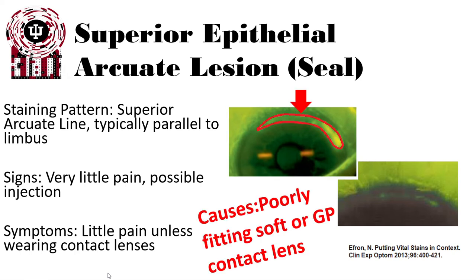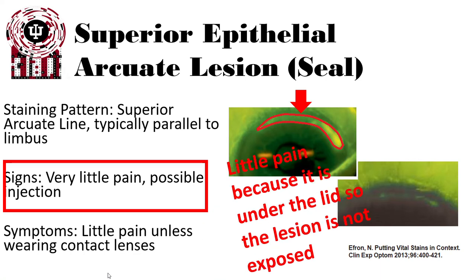I've outlined here so you can see the SEAL lesions in a little bit more detail. Oftentimes these are typically caused by poorly fitting soft or GP contact lenses.